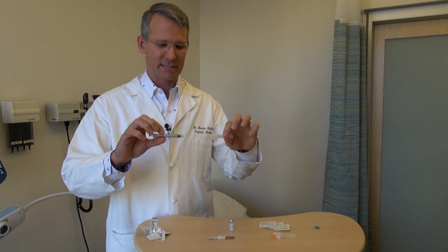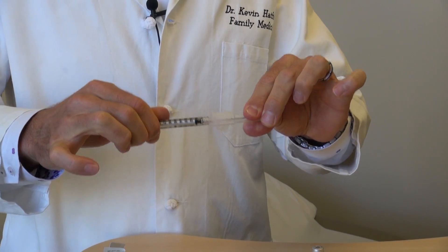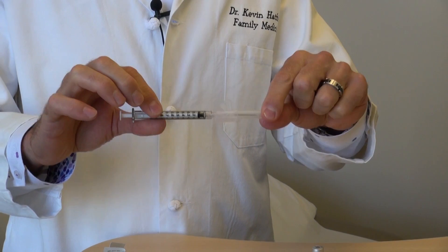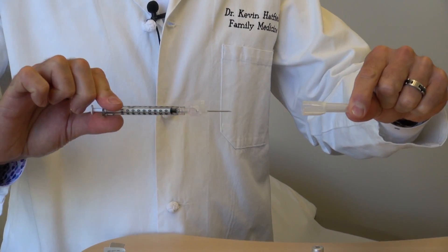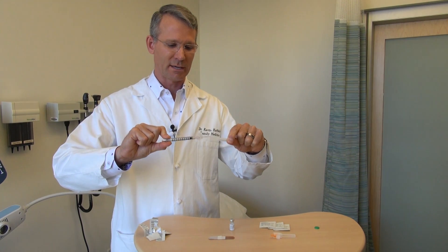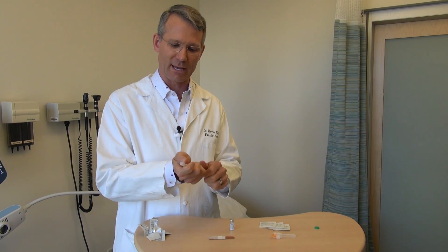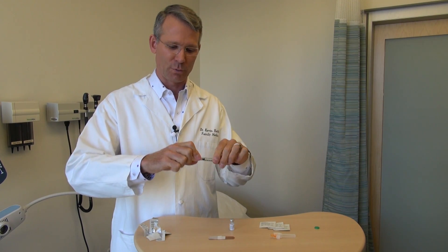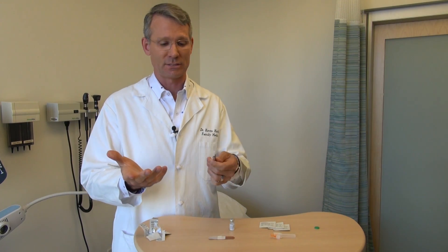To put the syringe together with the needle using this threaded style, make contact and give it about two-thirds of a turn until you feel it stop. Good uncapping technique is to take the needle and syringe in opposite hands and pull apart. You don't want to do one-handed uncapping where you pull it off with one hand over the needle, because if the needle touches your skin it's no longer sterile.